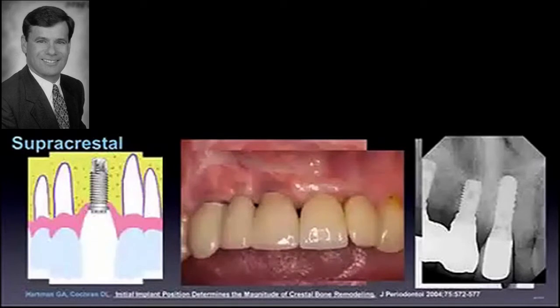And it doesn't take a rocket scientist to look at the comparison of tissue, and it's the same with a periodontal probe, that you have a much healthier environment associated with this supracrestal design than these implants that were placed years ago. So you're looking at almost 20 years on these, almost 10 years on this one, and yet this makes me happier. Makes me happier. So here you're looking at a little test right in our hands of our own practice.